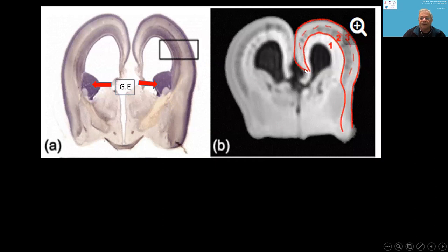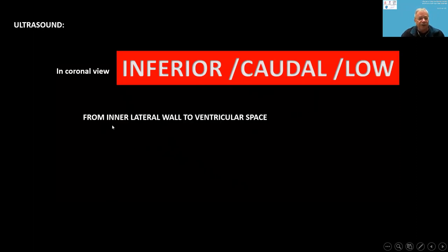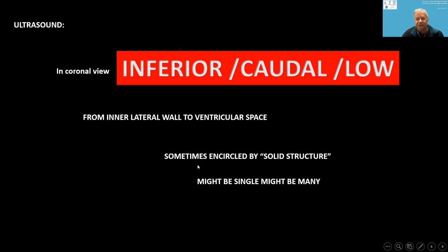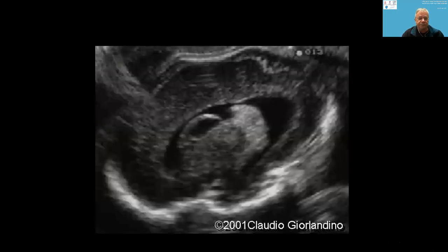Here is a micro-MRI of a fetus at week 12, showing the thalami and the ganglionic eminence. According to gestational weeks — very large at week 15, week 20, 26, 29, 36 — and around one year of life they disappear. On ultrasound in coronal views, they are inferior or caudal on the inner lateral wall of the ventricular space, sometimes encircled by solid structure. They might be single or multiple.